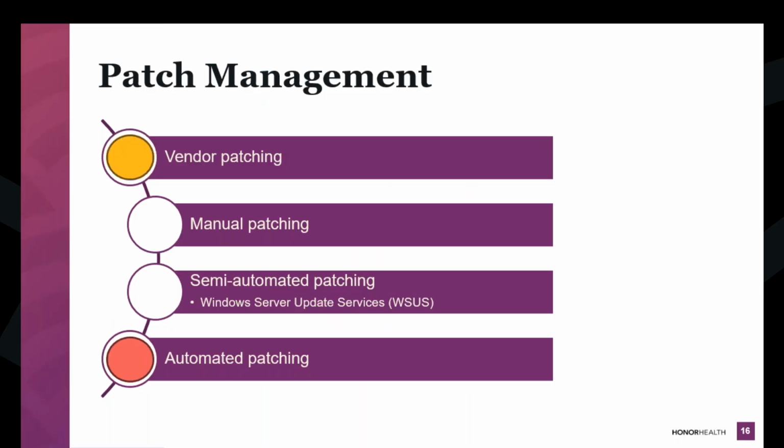The second part to that is you don't know if there's a patient on the device. So at 2 a.m., here comes the patching, right? And that's at the most critical time. So we really frown on automated patching just because on the other end of that device, it's a critical time frame. So yeah, vendor patching.